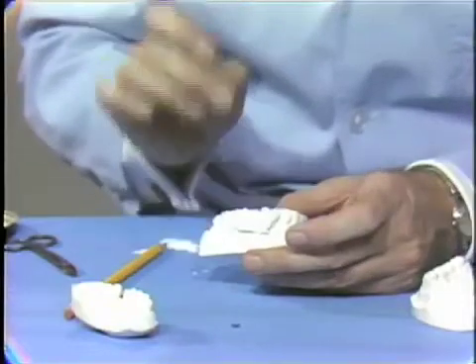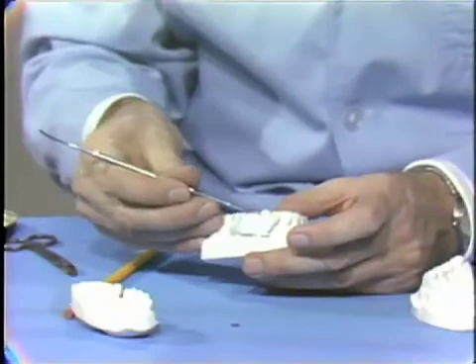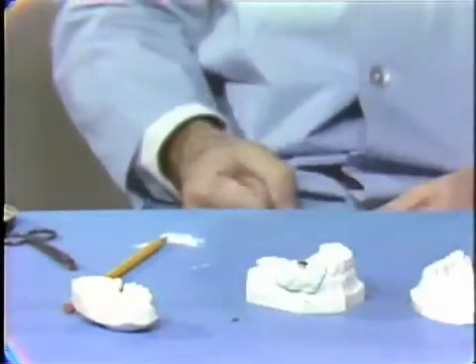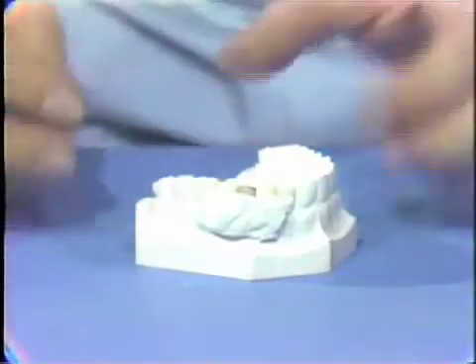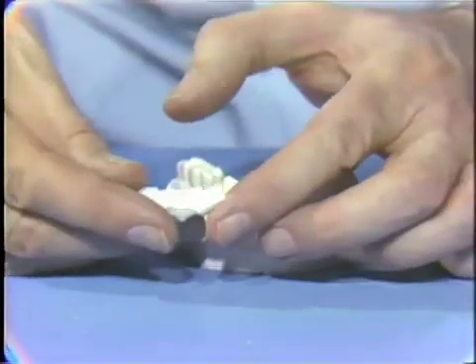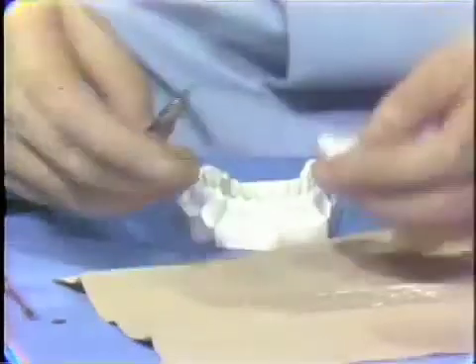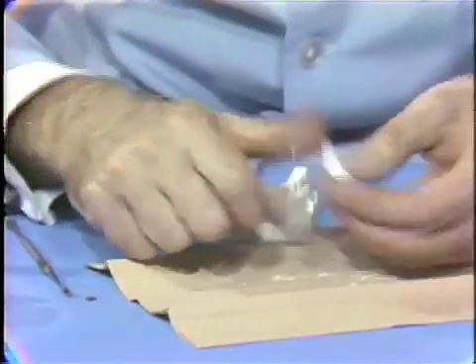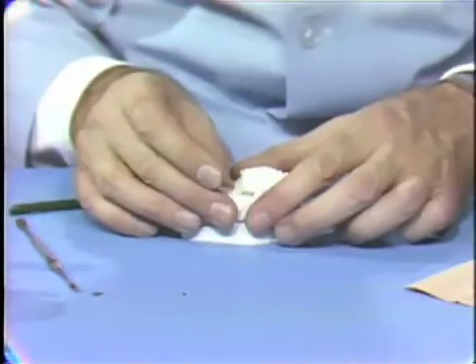Now, we'd probably better put that on one side and allow this to set. It will give us just a little break before we go back and pick this up and see what sort of core we've produced. The impression plaster is now set, and the core is ready to remove from the model, which is usually easily accomplished if a good job has been made of the waxing procedure. It's convenient sometimes at this stage just to trim the occlusal surface of this and level it off, just to give a sharp line of junction between the tooth and the plaster.